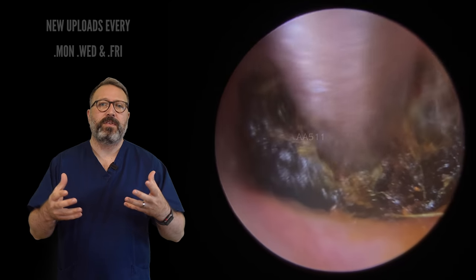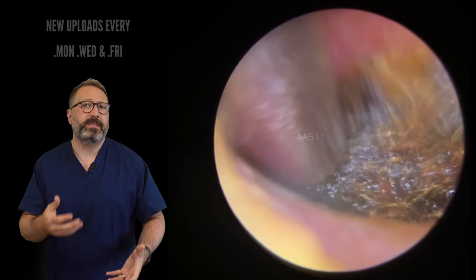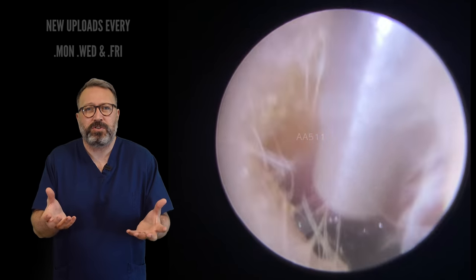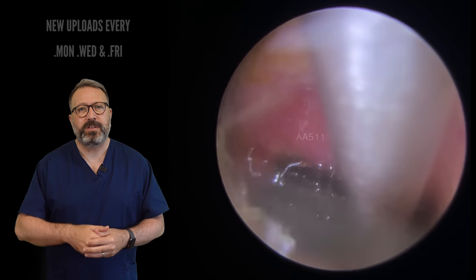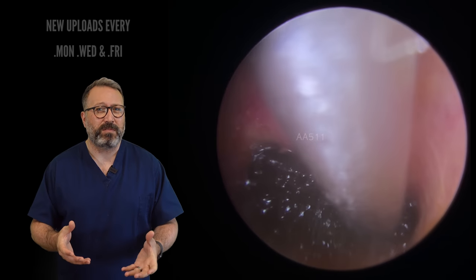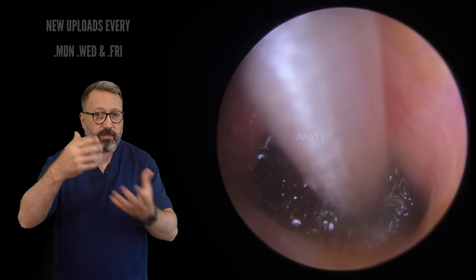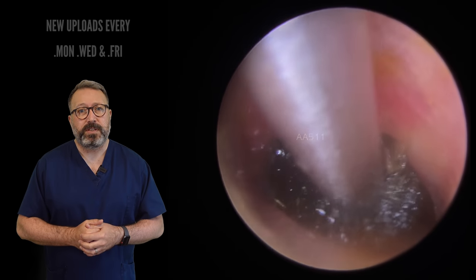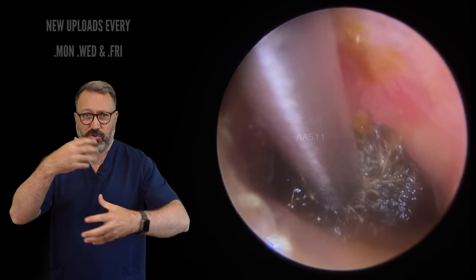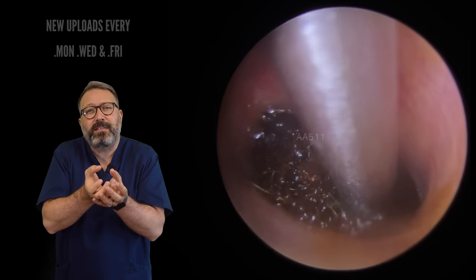The difficulty we have here in the UK at the moment — obviously following the pandemic — is that there are long waiting times through the NHS to get some of these services done. They've been shut down for such a long time and have a massive backlog to clear. So this lady had been referred into the hospital, but with this going on for nine or ten months, there was no sign of an appointment anytime soon, which is where she found us. We've been applying olive oil quite regularly just to try and help get a good suction grip, especially when the wax becomes this very thick clay-type consistency.